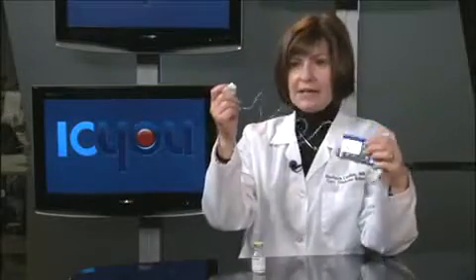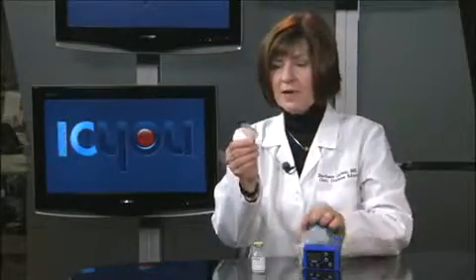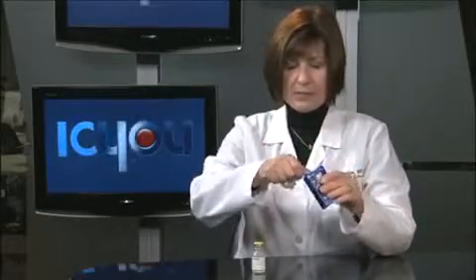So you wear it on the outside of your body, and then you attach it to your body with a cord and then a cannula. This is a rubber cannula that goes underneath your skin. It's actually a plastic cannula, and it's very small, and you change it out every 3 days. The insulin goes into a syringe inside the pump, right here. You fill it up, and then you put it in, and it starts delivering insulin.